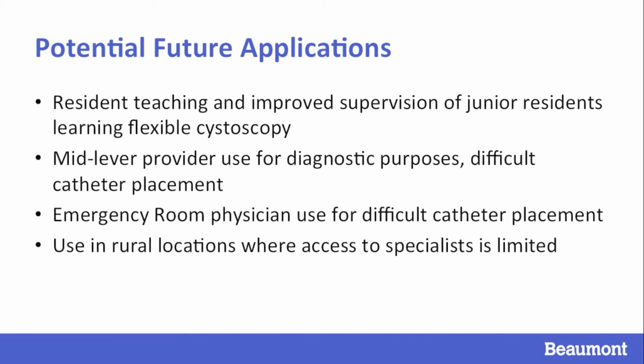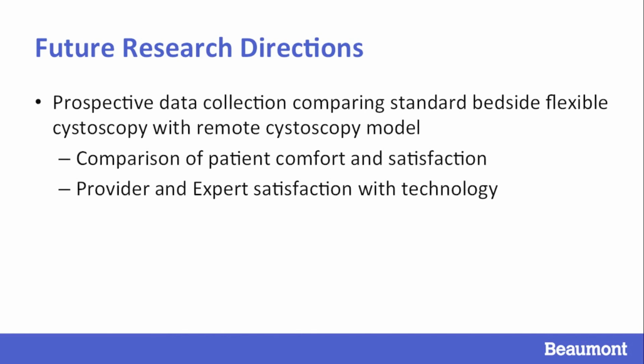Future applications for this technology include use for improved resident training in the performance of bedside cystoscopic procedures, mid-level provider use in performance of diagnostic cystoscopy, as well as difficult catheter placement, emergency room physician use for difficult catheter placement, and finally, use in rural locations where urologist is not readily accessible. Next steps for study of remote cystoscopy will include prospective data collection comparing standard bedside flexible cystoscopy to remote cystoscopy model to demonstrate non-inferiority. Thank you.